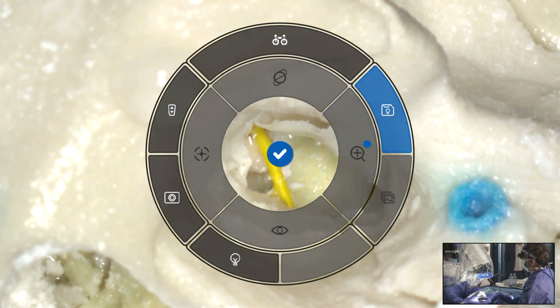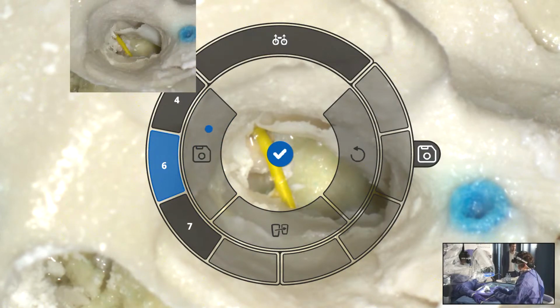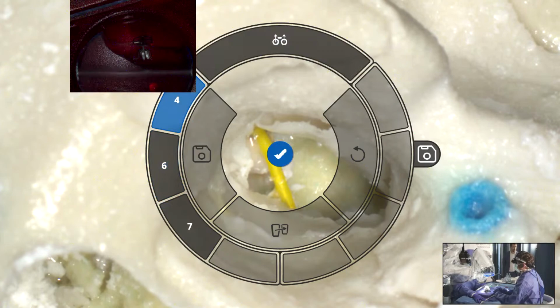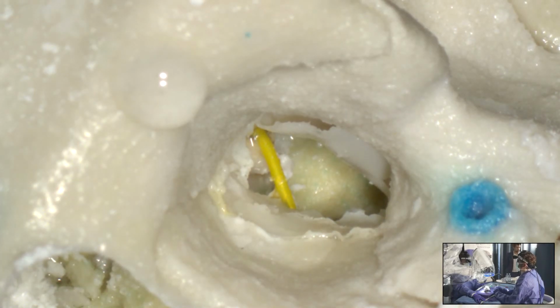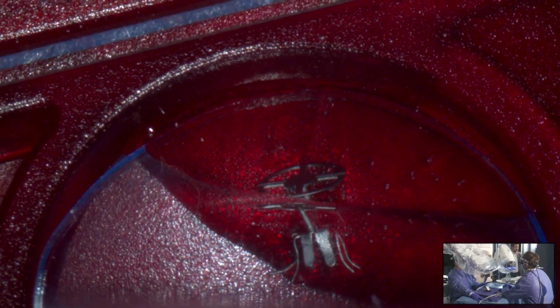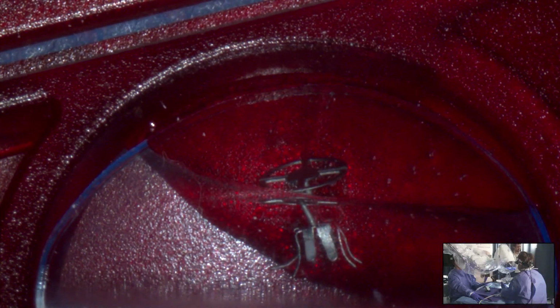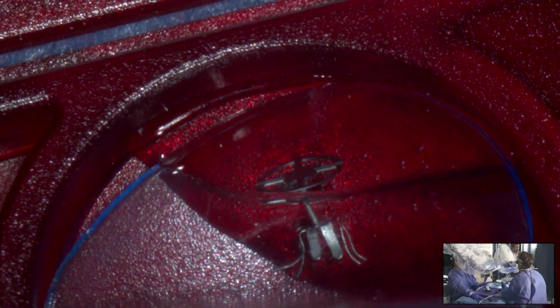Number one. Let's see. Right. Usually we take a picture when the position is done, just to make sure that you don't have to remember which positions you have saved, what is number 1, number 2, number 3, and therefore we are taking an image while saving the position from the robotic position. Now what you can see is a passive middle-ear prosthesis, a titanium prosthesis, thankfully provided by Uwe Steinhardt from Medel. And this is one of the latest generations, which is now on the market.